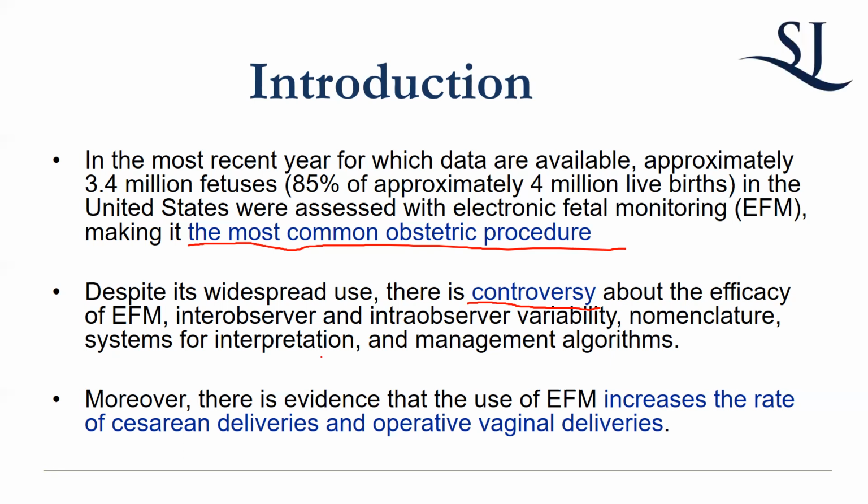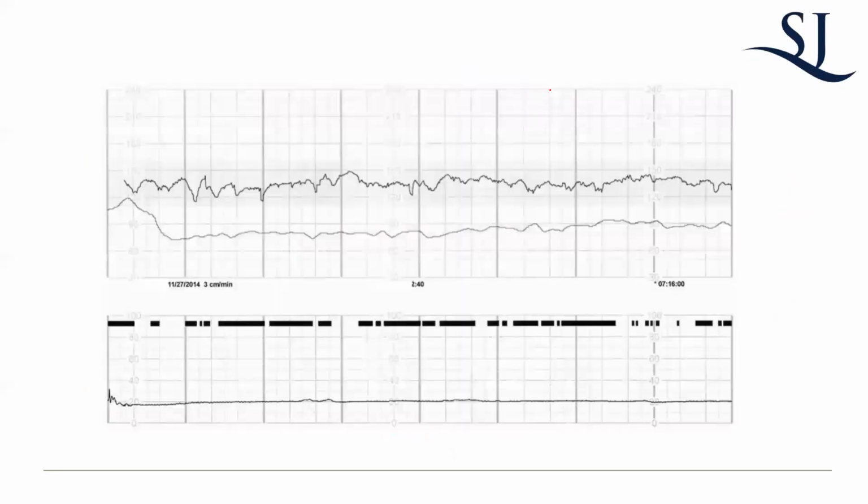But as a clinician, I'll tell you, there have been emergency situations which the fetal heart rate monitor, the electronic fetal monitoring, has most certainly identified, and truly so. And other times you have to be a bit more conservative about what it's telling you, and be more likely to resuscitate versus doing a cesarean delivery, because it's something that, while concerning, can resolve. And hopefully you'll have a better sense of that after this presentation.